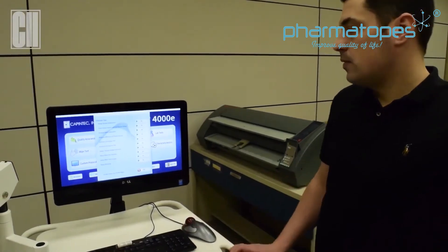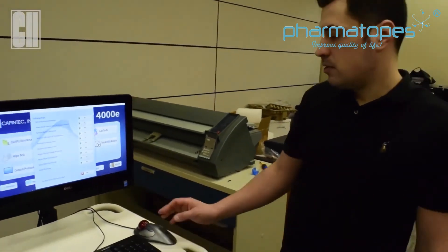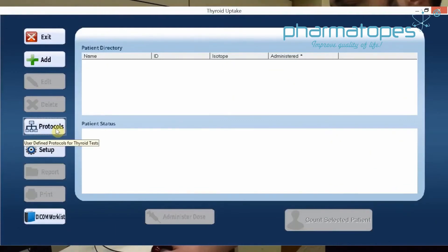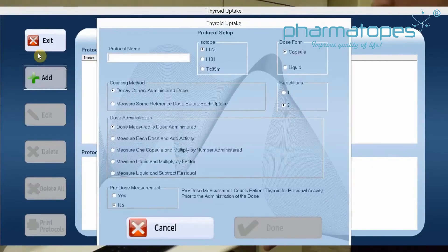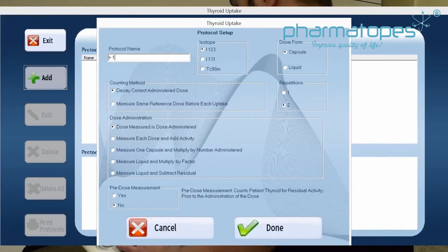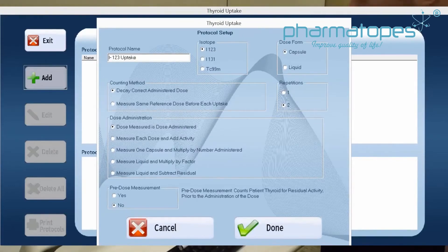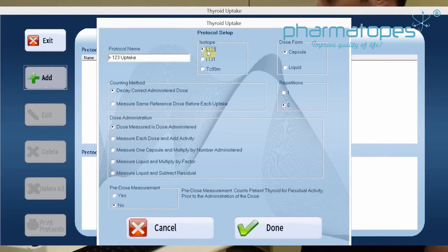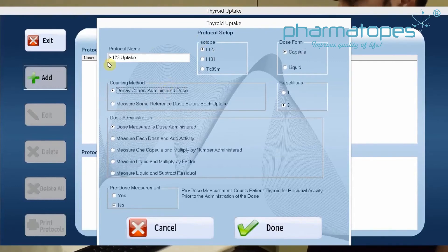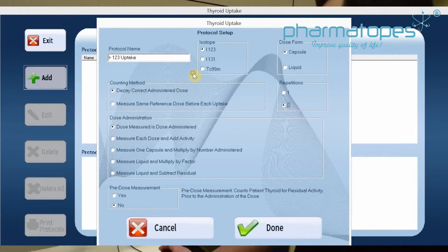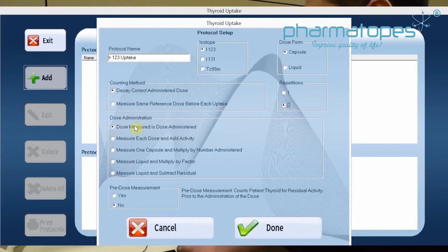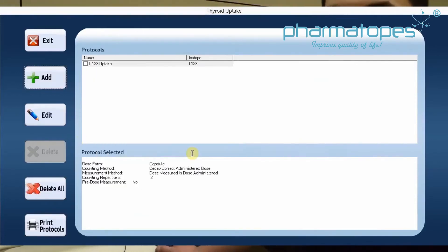The next step is to set up thyroid protocols prior to using the system. Click on the thyroid uptake protocol and go to Add. This is where the user will add their standard protocols. In this case, we're going to add an I-123 uptake, select I-123 in capsule form, and use the counting method as decay-corrected administered dose. We're going to set it as two repetitions, meaning it will count twice during each uptake. For dose administered, we're going to select dose measured as the one we administer. Once complete, click Done — we now have the protocol added.